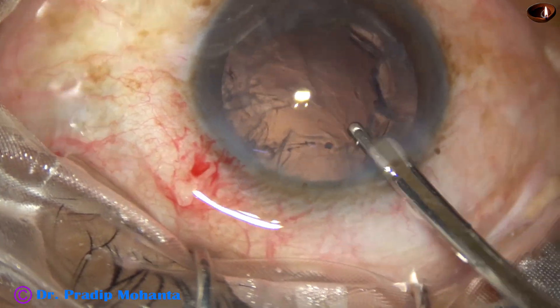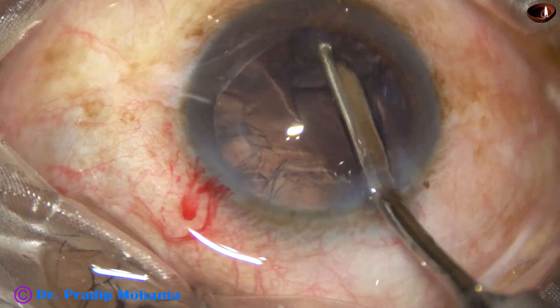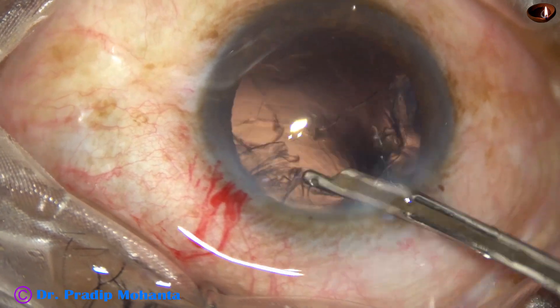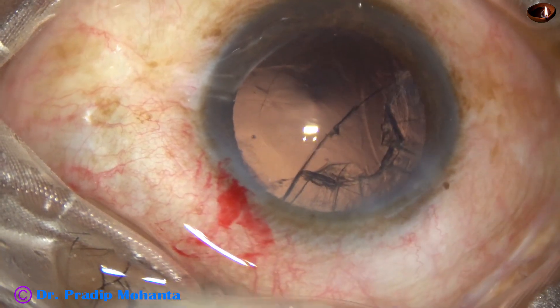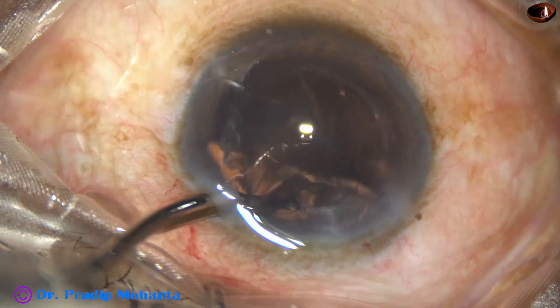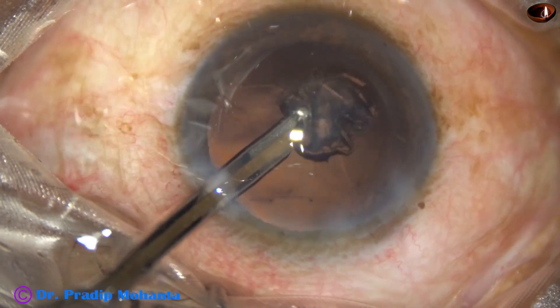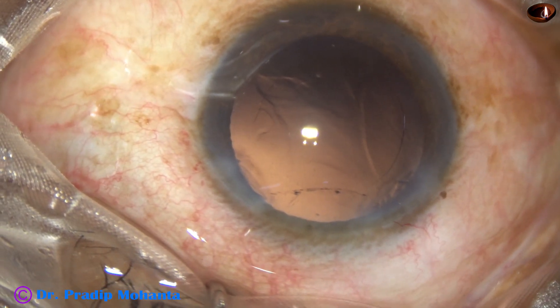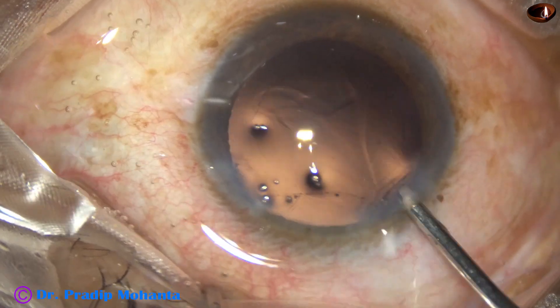All the pieces are removed. Now we go to remove the cortex. Through the main wound, we have removed the cortex from about 3 o'clock to 7 o'clock. Then going through the side port, the rest of the cortex is removed from 9 o'clock to 2 o'clock. The side port is a bit large, but it is 3 clock hours away from the main wound, so astigmatism produced by the main wound will be neutralized to some extent by the side port.